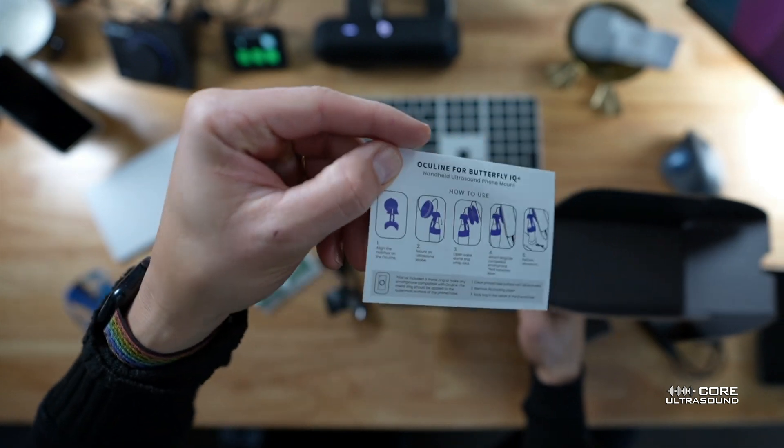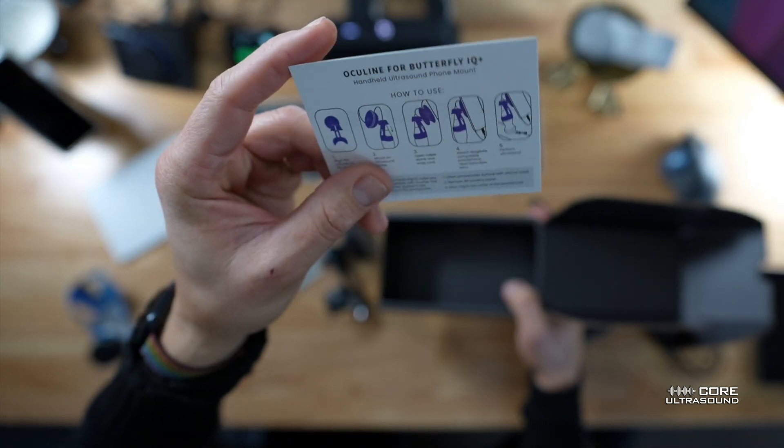Just in case you didn't watch this tutorial, there is a little card that tells you how to use it.